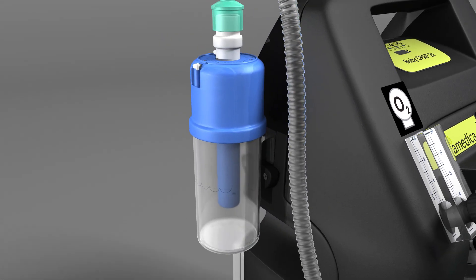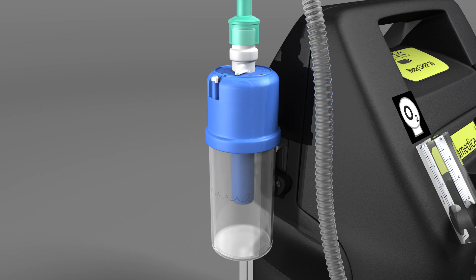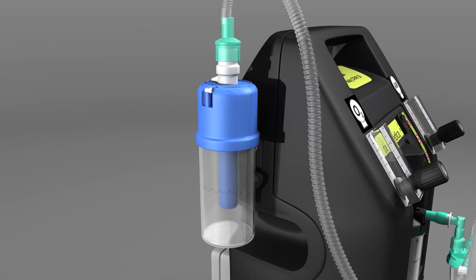The CPAP pressure is controlled by the bubble bottle. The depth of the bubbler determines the pressure delivered to the patient.